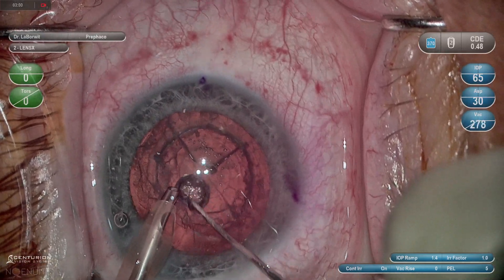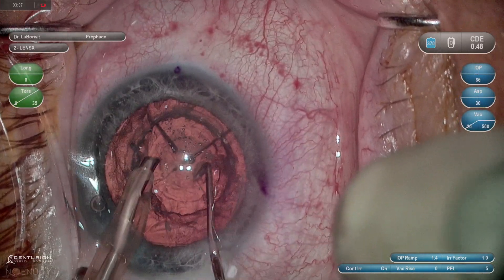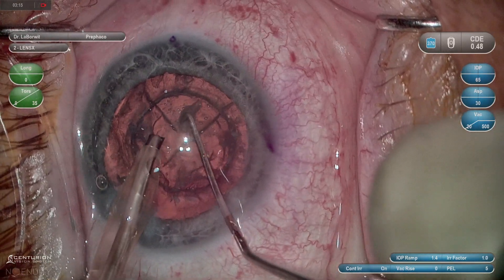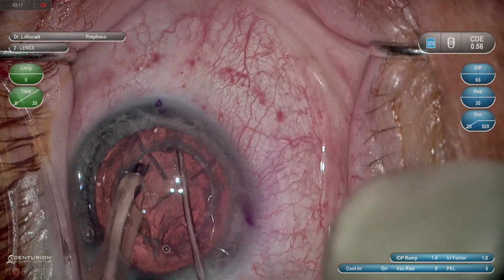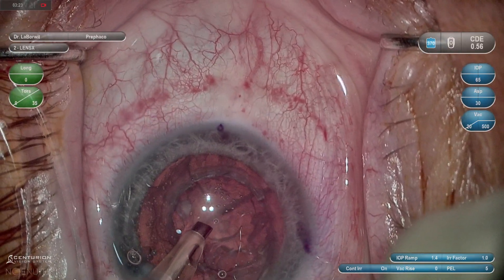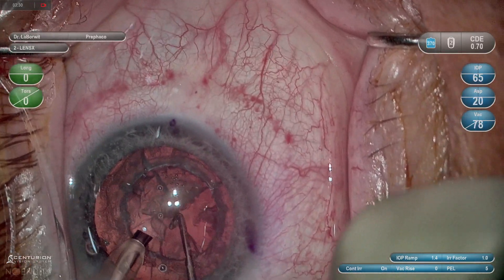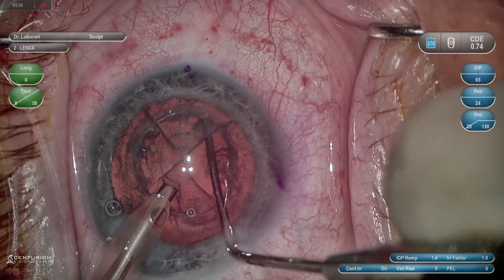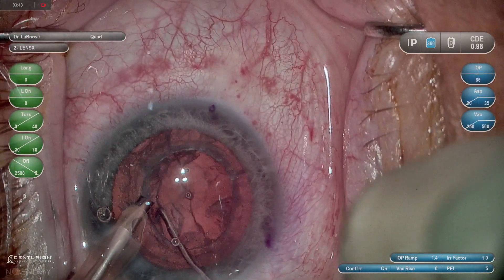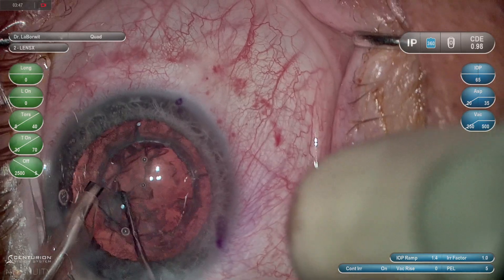The hydrodissection allowed the top half of the cylinder cuts above the horizontal cut to come up, and you can see I can then use the chop to crack the rest of the core area and cylinders. Because I have the horizontal cut at a specific percent of the lens, I now know where I am in the lens and can more confidently reach with my second instrument to lift up the other half of the posterior lens material. Between the active fluidics and the depth gauge provided by that horizontal cut, it gives me more opportunities to remove the densest part of the cataract in a safer manner.